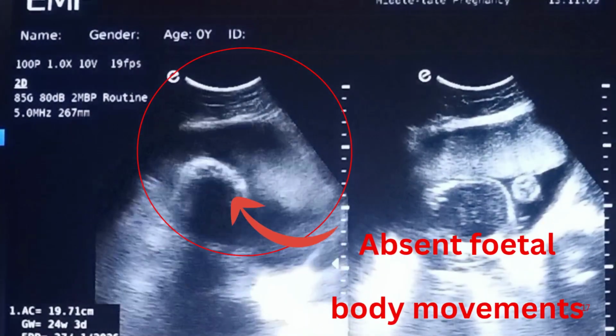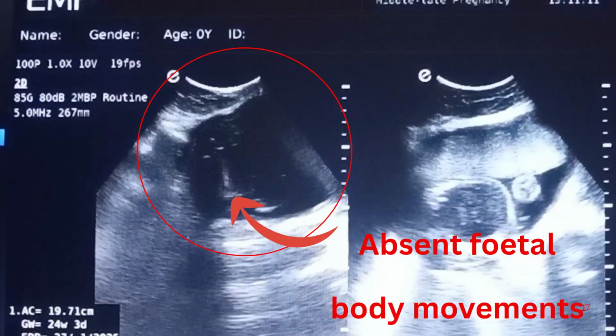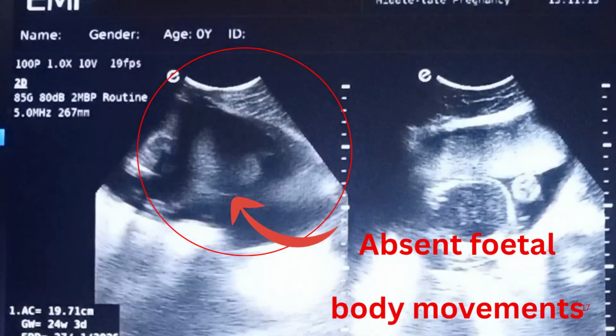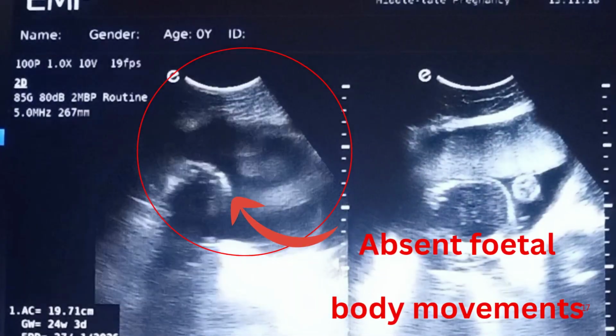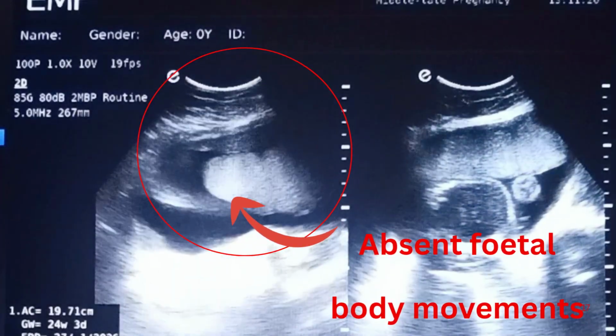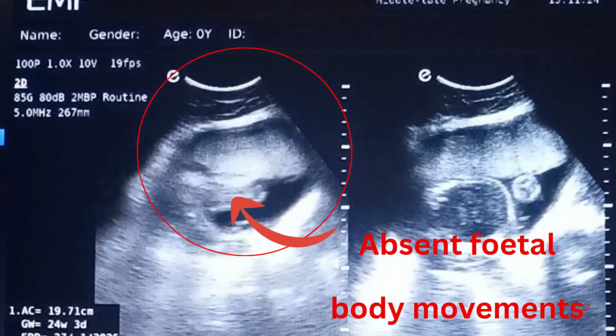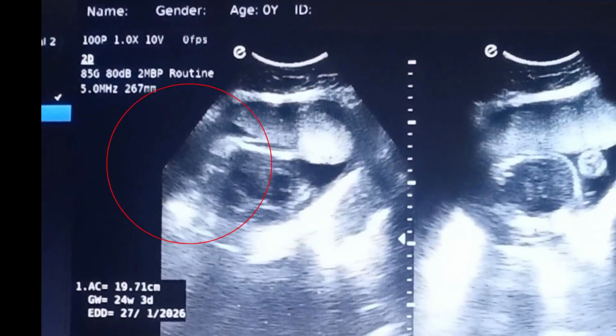The fetus appears motionless throughout the examination, with no spontaneous limb, trunk, or gross body movements detected in real-time ultrasound observation. This finding may be suggestive of intrauterine fetal demise, IUFD, when correlated with absent cardiac activity and other supporting sonographic features.